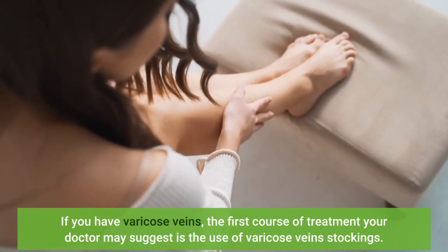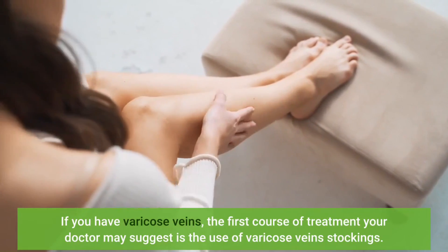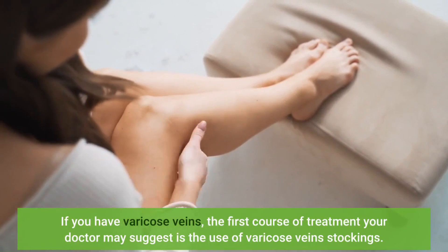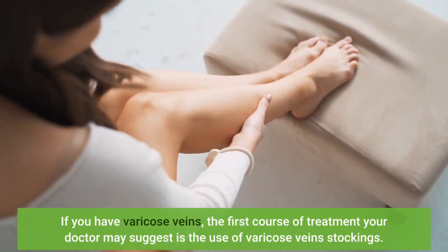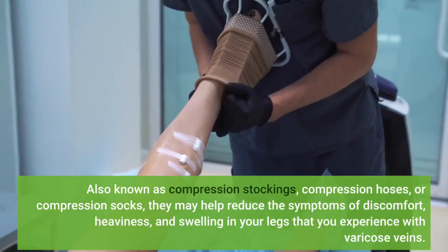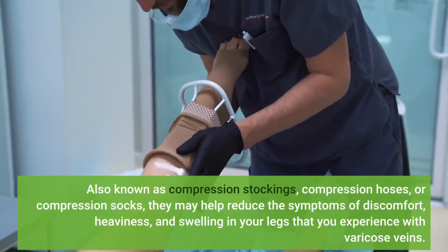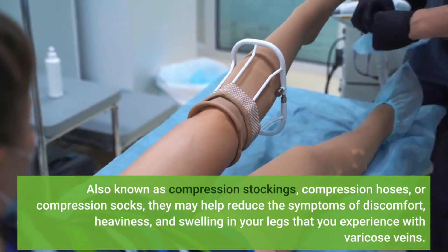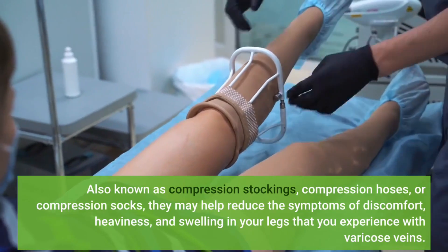If you have varicose veins, the first course of treatment your doctor may suggest is the use of varicose vein stockings. Also known as compression stockings, compression hoses, or compression socks, they may help reduce the symptoms of discomfort, heaviness, and swelling in your legs that you experience with varicose veins.